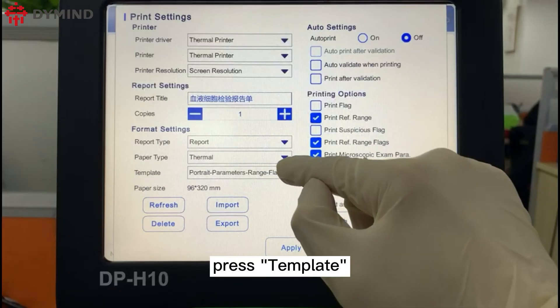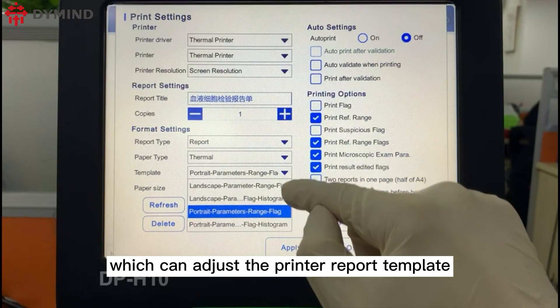Click Print Setting, then press Template, which allows you to adjust the printer report template.